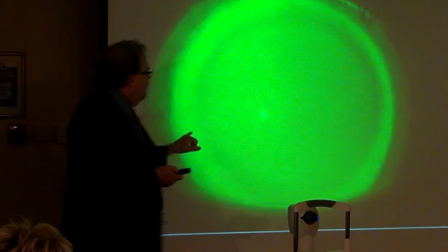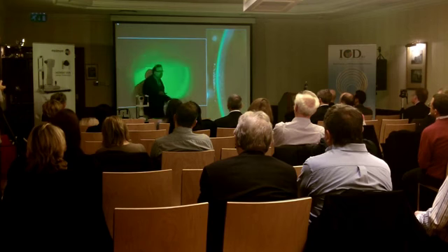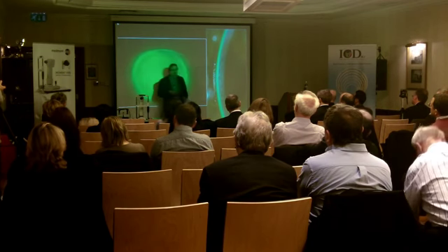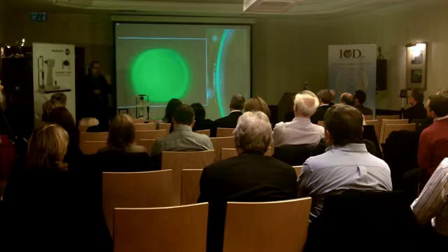Now we're going to do that by looking at the contact lens in optic section. When we see the thickness of the tear lens and the thickness of the contact lens the same, it is a really good estimate as to how much central clearance we have to that contact lens.